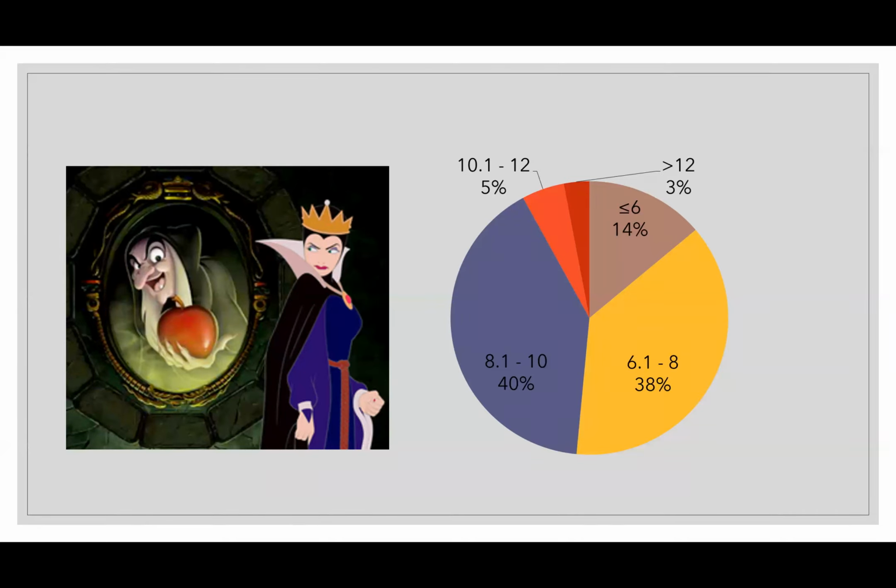If you're like this witch on the left, you think that, well, that's just what you're telling us, we already do a great job. I'm going to try and explain why I don't think we do the greatest job. So this was an audit from MSICU a few years ago, and I would posit that it's similar to the CCTC culture. This is a pie graph showing the distribution of tidal volumes.